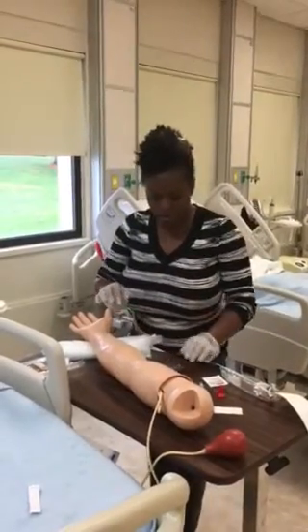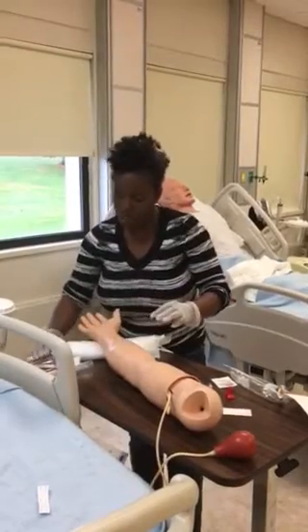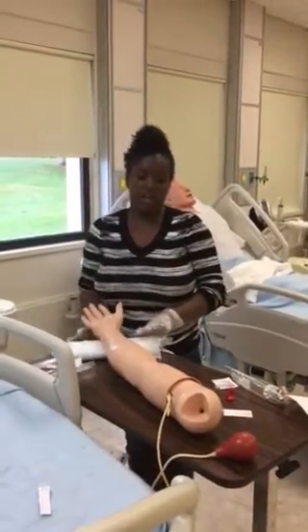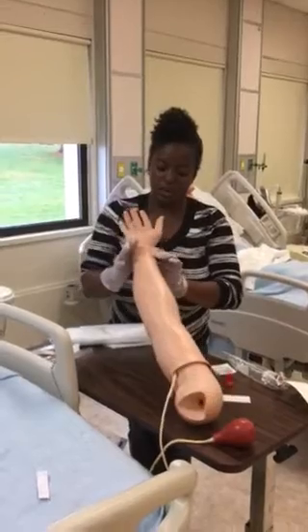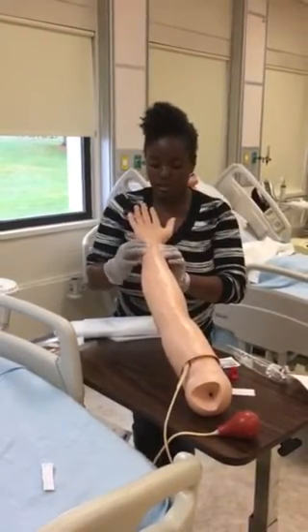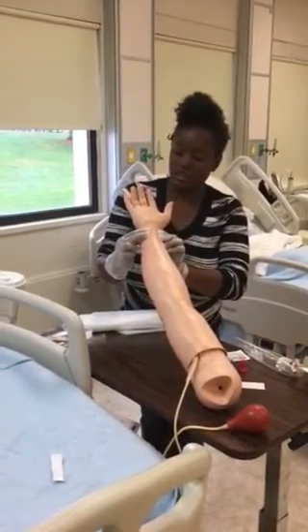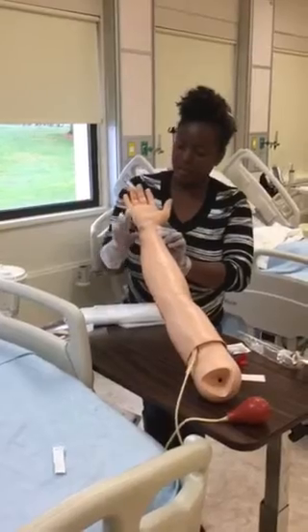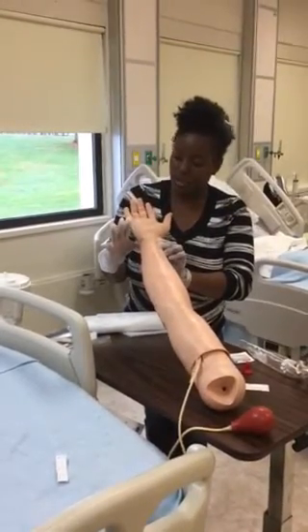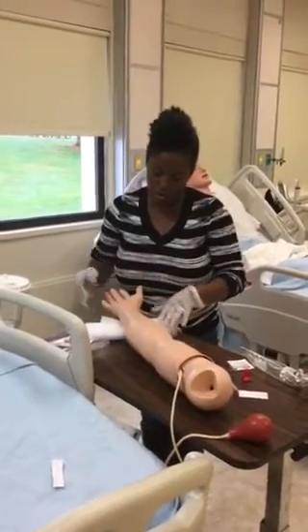Alright, and before I start the ABG, I'll perform the modified Allen test. I'll tell the patient to raise their hand, and I'll palpate the radial artery and the ulnar, and then I tell the patient to squeeze their hand and release, and squeeze and release, and then I release the ulnar, and then I look for recirculation within 10 seconds.